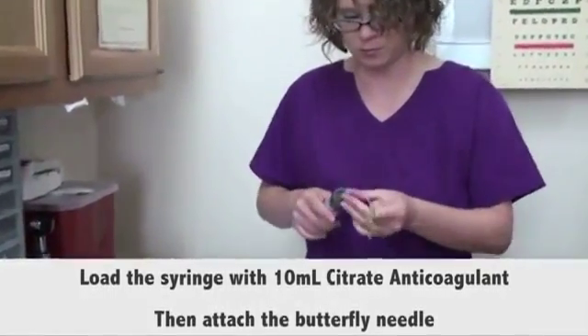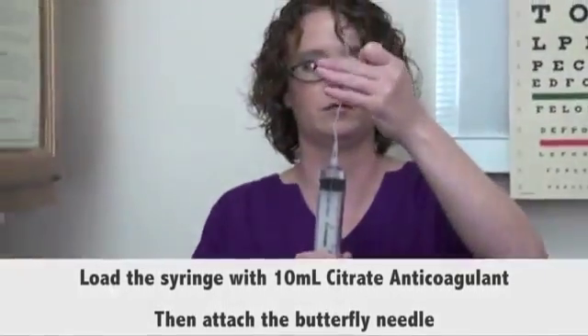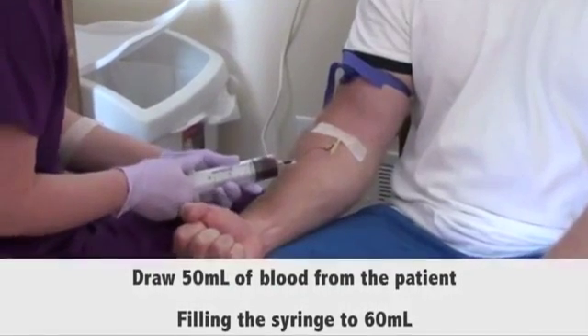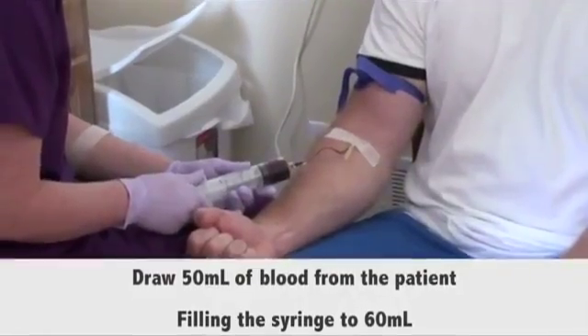attach the butterfly needle to the 60 milliliters syringe. You may also prime the needle. Using sterile technique, draw 50 milliliters of blood from the patient, filling the syringe to a total of 60 milliliters.